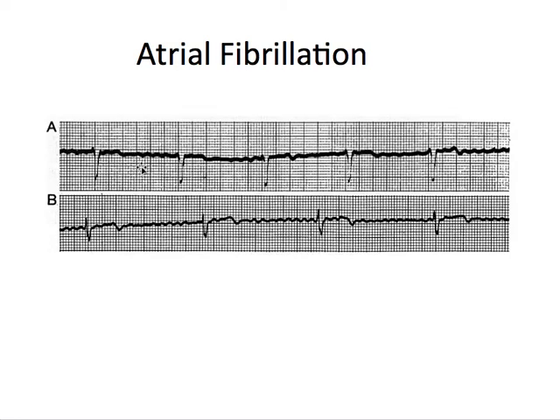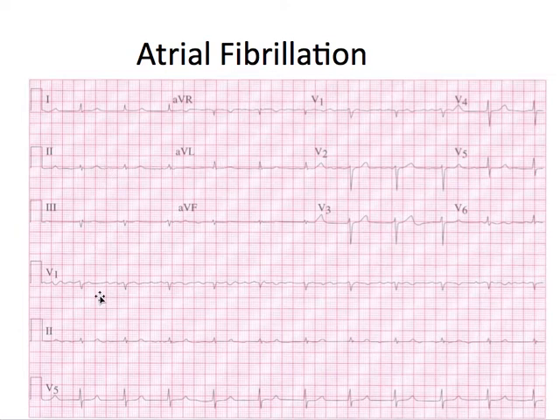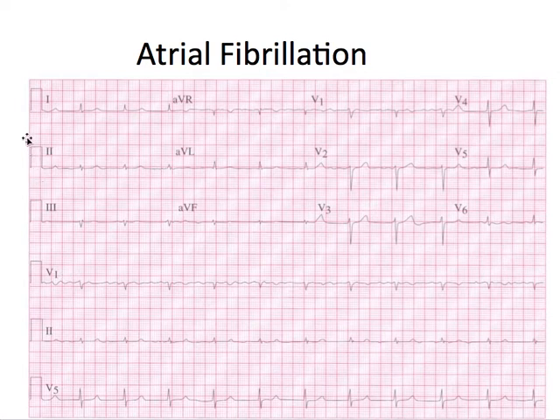Here's some fine AFib — a really nice looking fine AFib with a low ventricular capture rate. Another one on a 12-lead EKG, also fine AFib. Notice how you're not really seeing it in lead one or lead two, but you see it in the precordials. That can be common, so you've got to make sure you check all your leads. You can see this irregularly fluctuating electrical baseline, which is indicative of an AFib heart conduction.